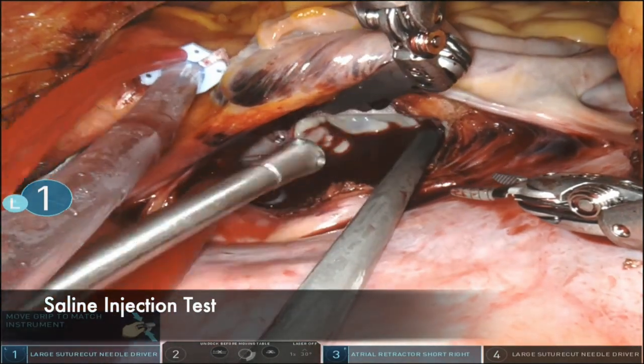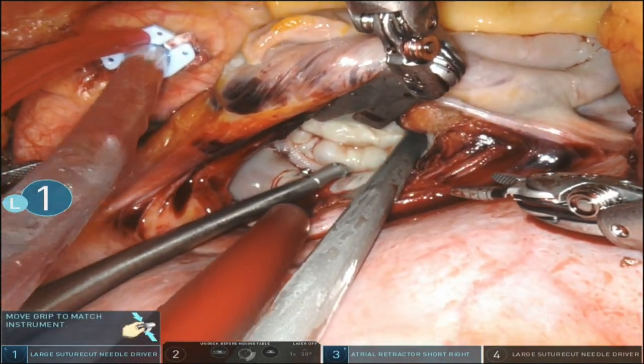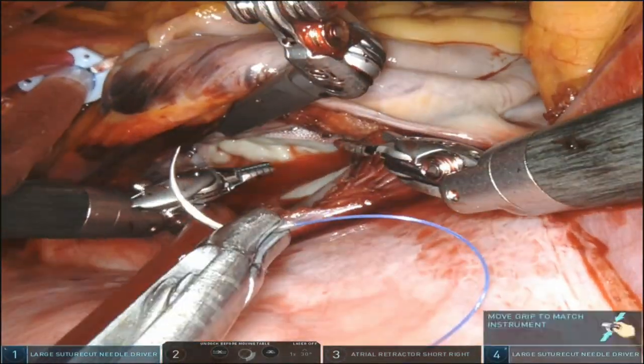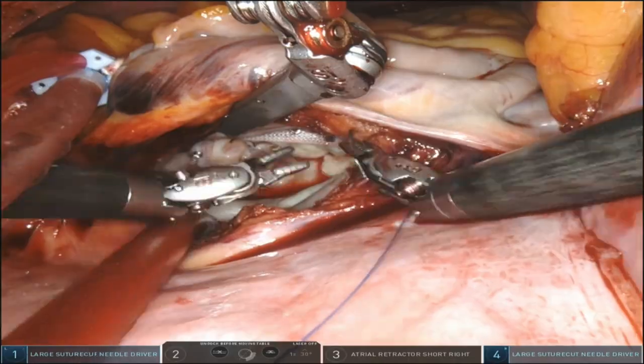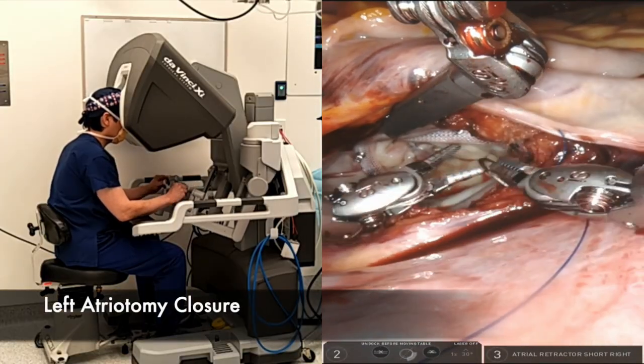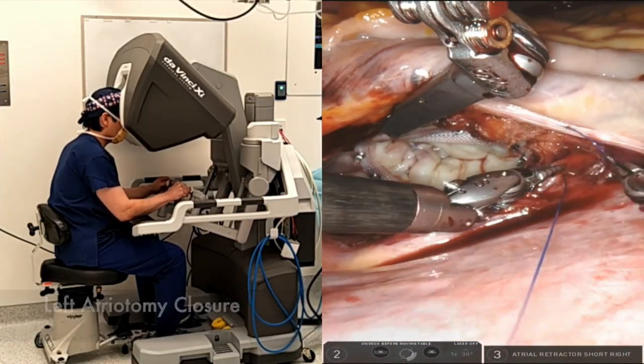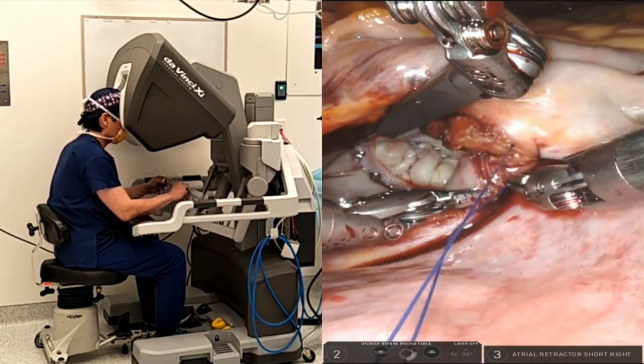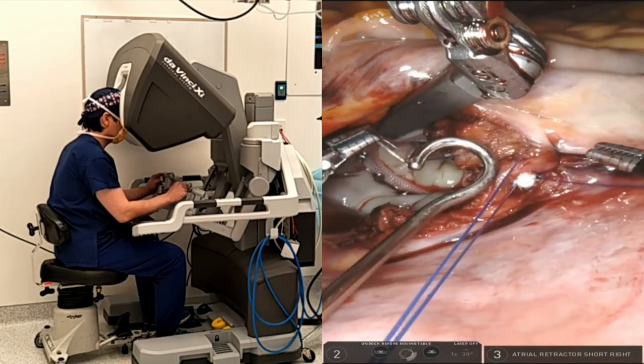Now I do the saline injection test. If the ventricle distends, the chances are your mitral repair is going to work. I use two layers of 3-0 running prolene suture to close the left atrium. This is the time you can practice suturing with both hands up and down the atriotomy incision.